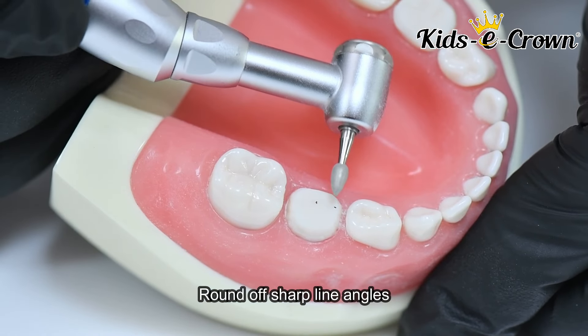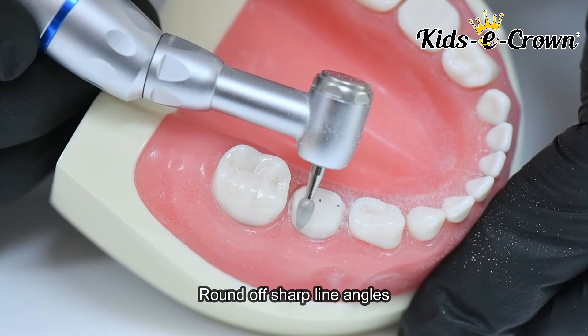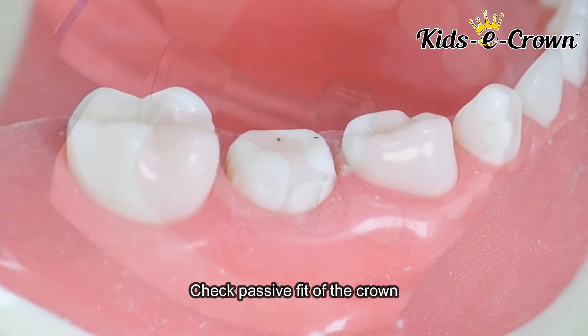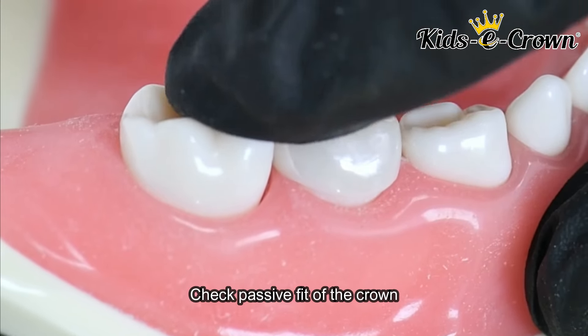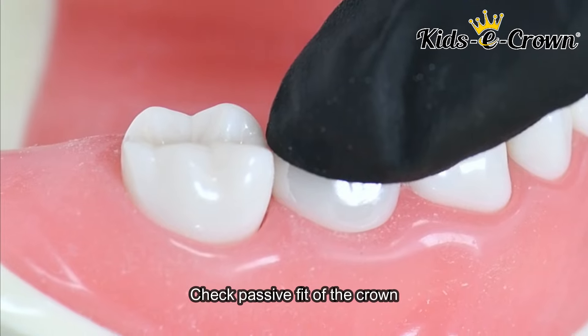The next step is to round off all the sharp line angles. Then you check the passive fit of the crown, and you cement the crown using luting glass ionomer cement.